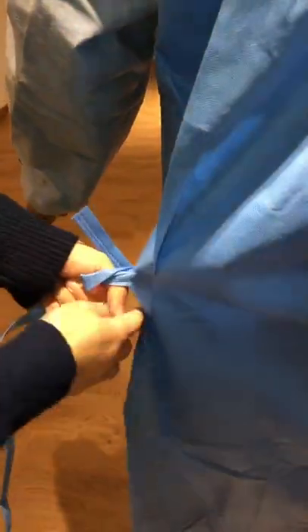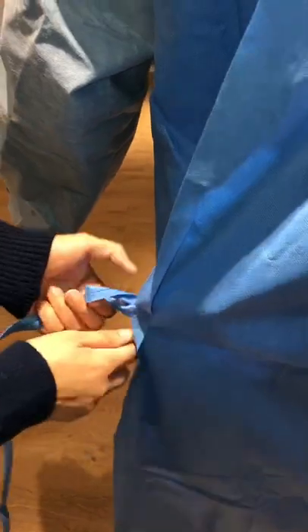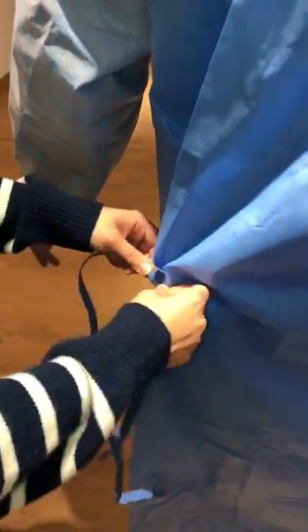I can show you the inside. There are two ties inside and two ties outside, which make sure the back is fully covered.